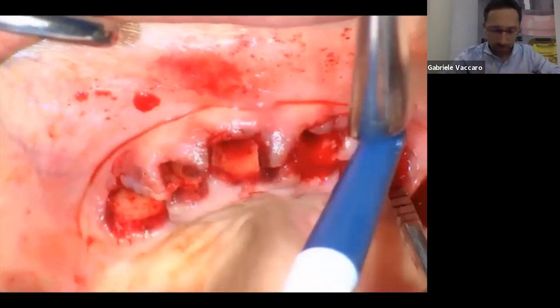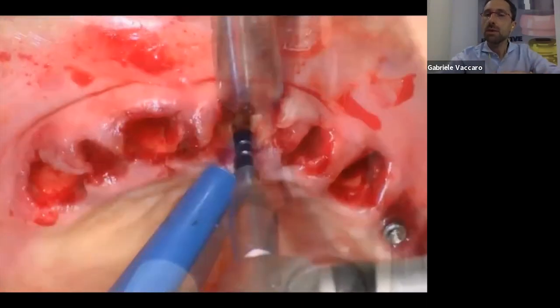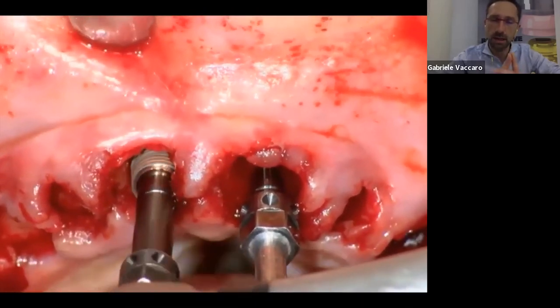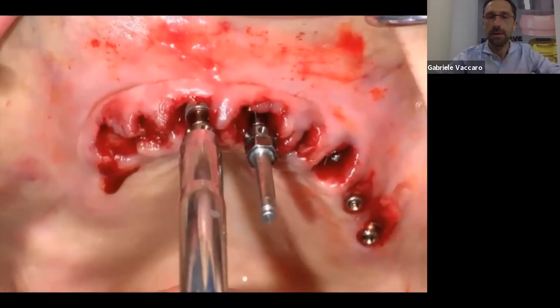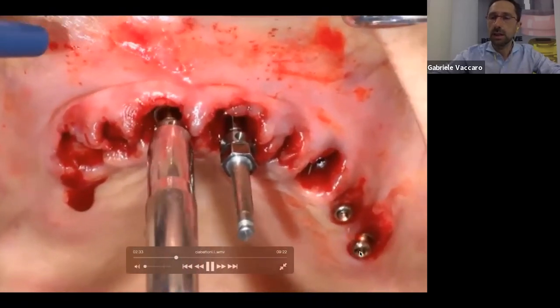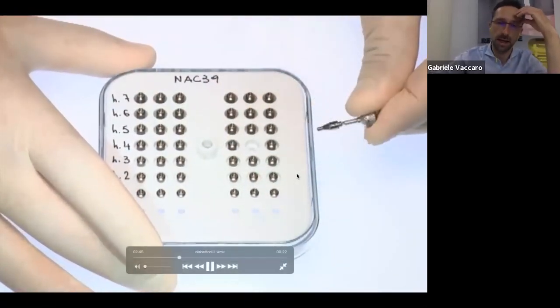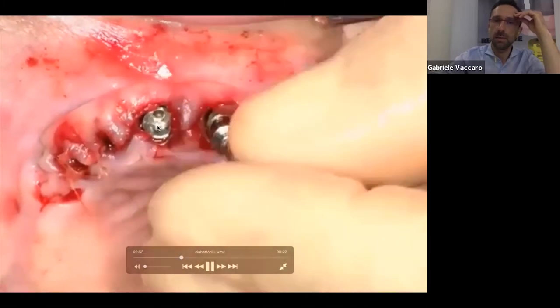But we have that impression tray that we will match, we will glue in with the frontal incisor, and we will take the impression with that. After this, once I am sure that everything fits perfectly, the impression tray is the first step, and it's very important to check that everything is right with that. After that, I can start the surgery and put implants where I want to put them. As you can see here, you see the two old implants, and I put over these two old implants my two new equator, one and two. I take new equator for the new implant that I'm putting right now, and close the hollow body of the implant once forever.